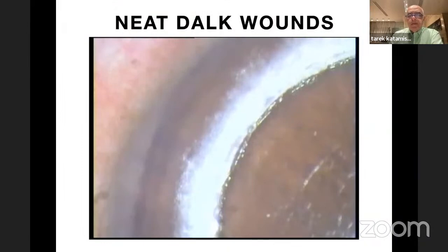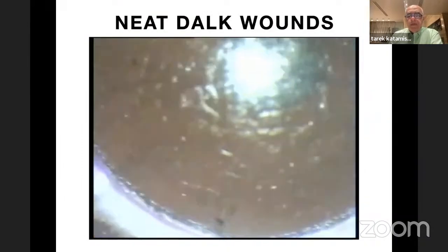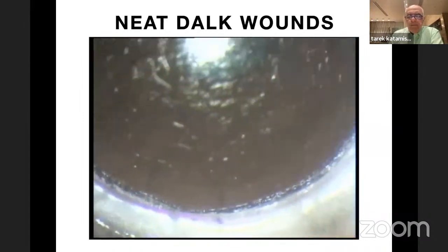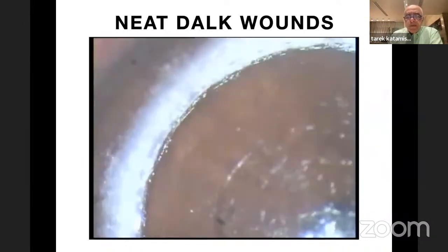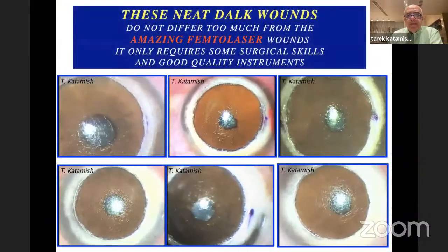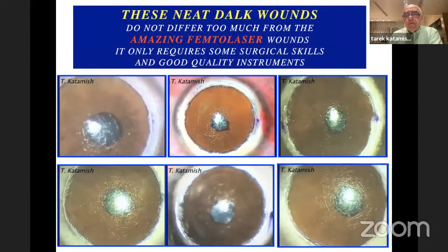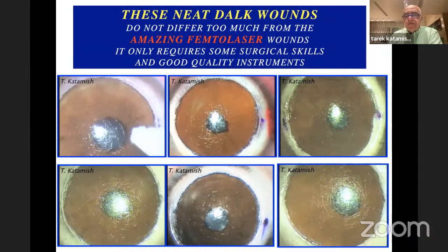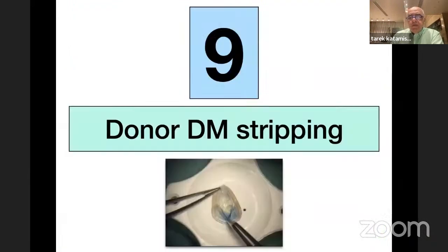As I always say, look carefully how neat the wound is. This is a wound made by simple instruments, not by femtolaser. So these neat DALK wounds do not differ too much from the amazing femtolaser wounds. It only requires some surgical skills and good quality instruments.